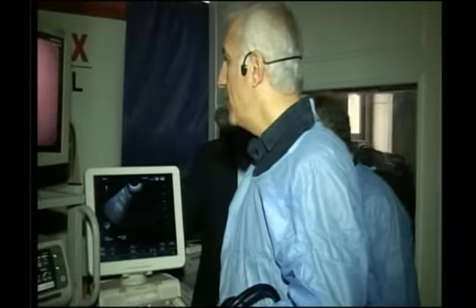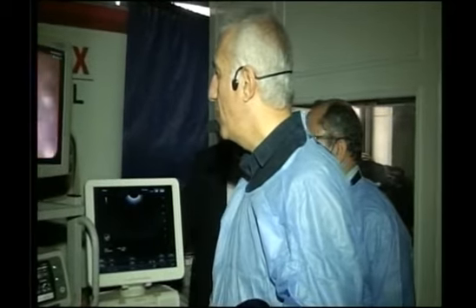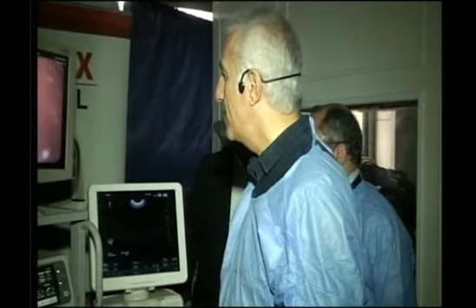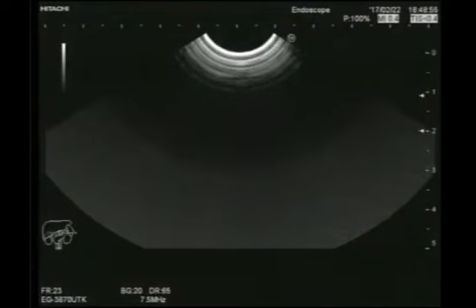This patient presented with a quite characteristic picture of an obstructive jaundice, and in ERCP they found a tumor, and the biopsy revealed villous adenoma, and they put a stent to relieve the jaundice, as far as I understand.